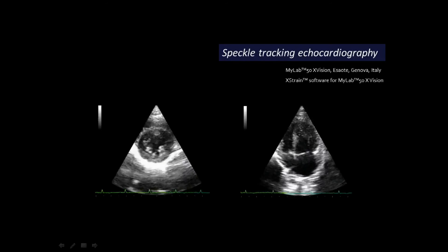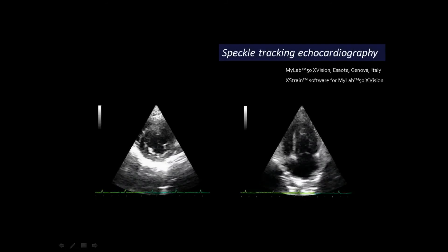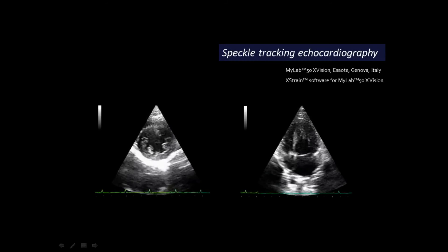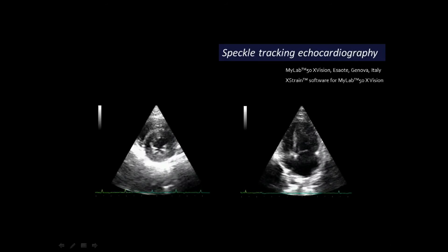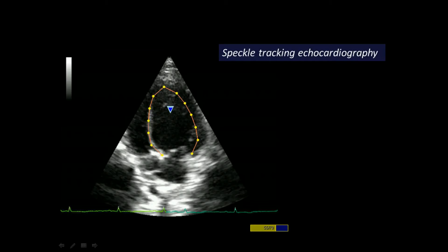We collected 34 clinically healthy cats. Each of them underwent B-mode echocardiography in the right parasternal short axis view and left parasternal apical four-chamber view to obtain standard images for speckle tracking processing. We divided the myocardium into six segments and calculated circumferential strain and strain rate, as well as radial strain and strain rate. We also divided the myocardium in the right parasternal apical four-chamber view into six segments and calculated longitudinal strain and strain rate.